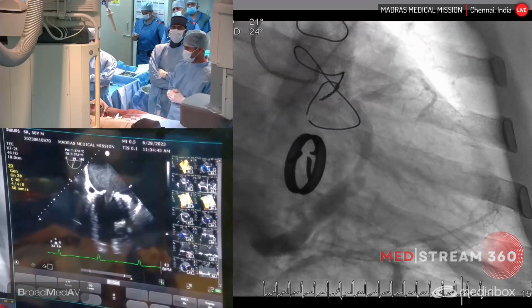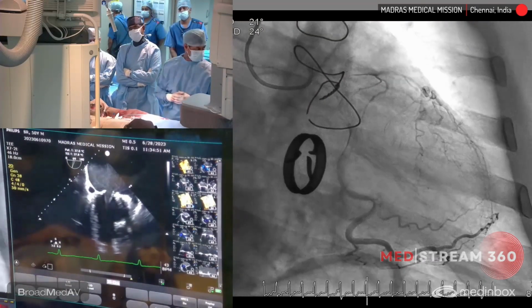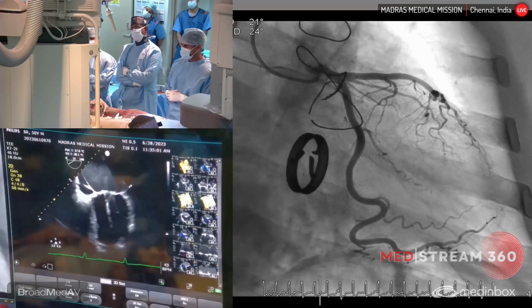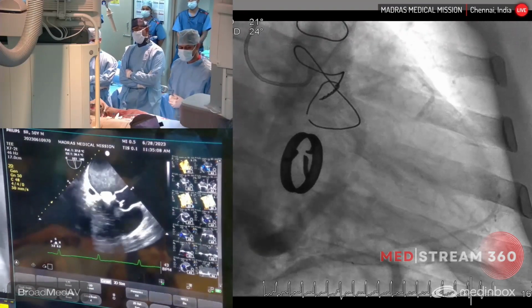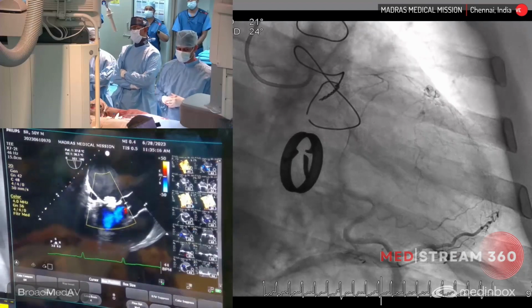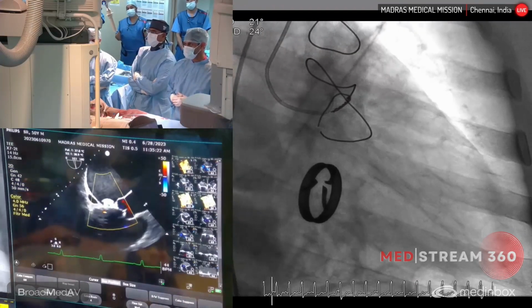So this was a demonstration of a medially located paravalvular leak in a 14-year-old single leaflet mechanical prosthesis where the radio opacity of disc was not there, forcing use of echocardiography to assess the valve leaflet mobility. We performed the paravalvular leak closure by combining echo navigation, which means fluoroscopy guided by echo navigation, and we are able to clearly see that the paravalvular leak is completely closed off, and both the devices are seen very clearly.